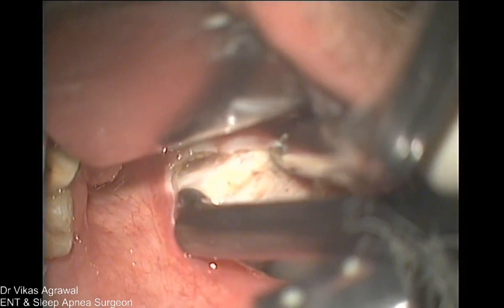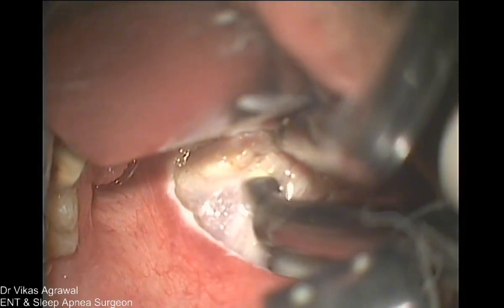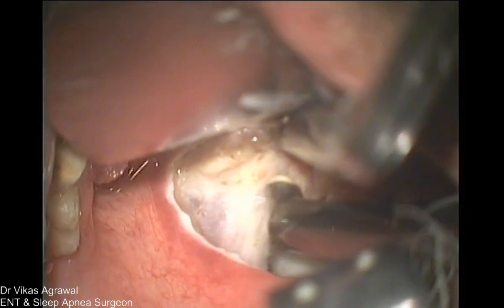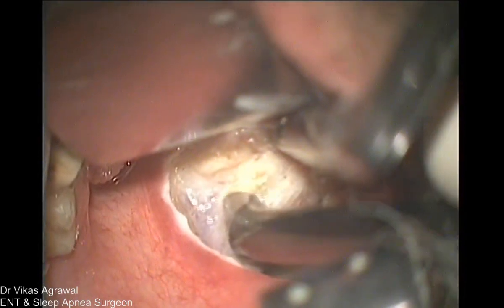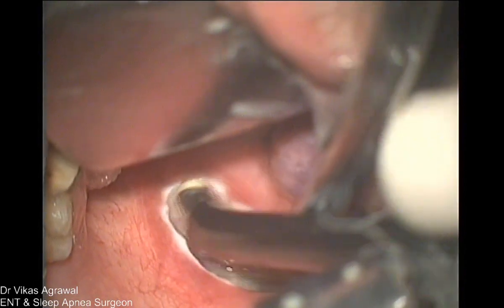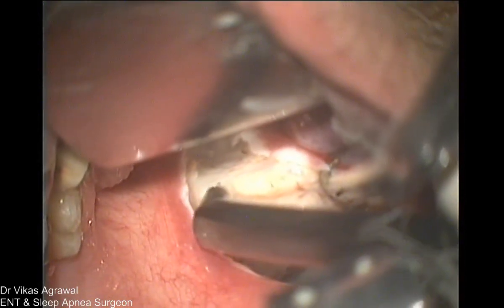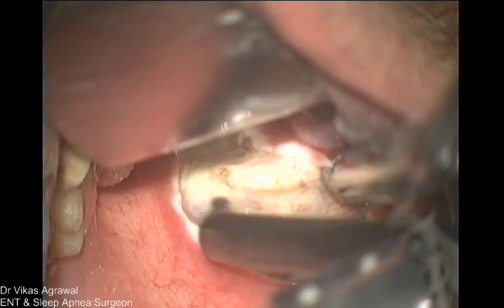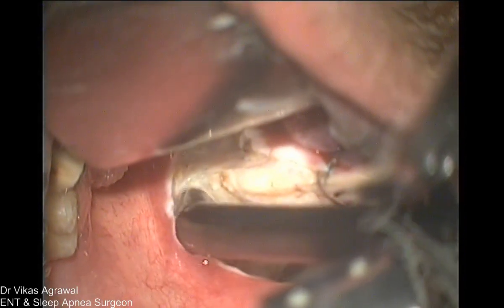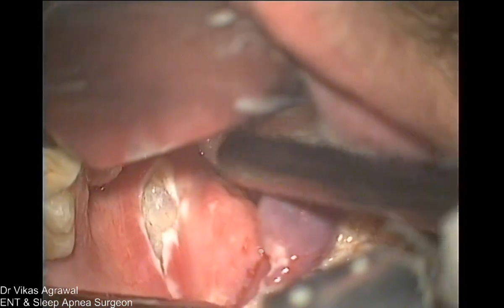There's a question: what do you do to coagulate with Coblator? So there is a coagulation pad. I'll show you the coagulator in the last. The yellow pad is for ablation and the blue one is for coagulation. So I am coagulating with the blue pad. With the yellow pad I am ablating. And for ablation you have to hover over the tissues. You don't have to press into the tissues. For coagulation you have to touch the tissues.